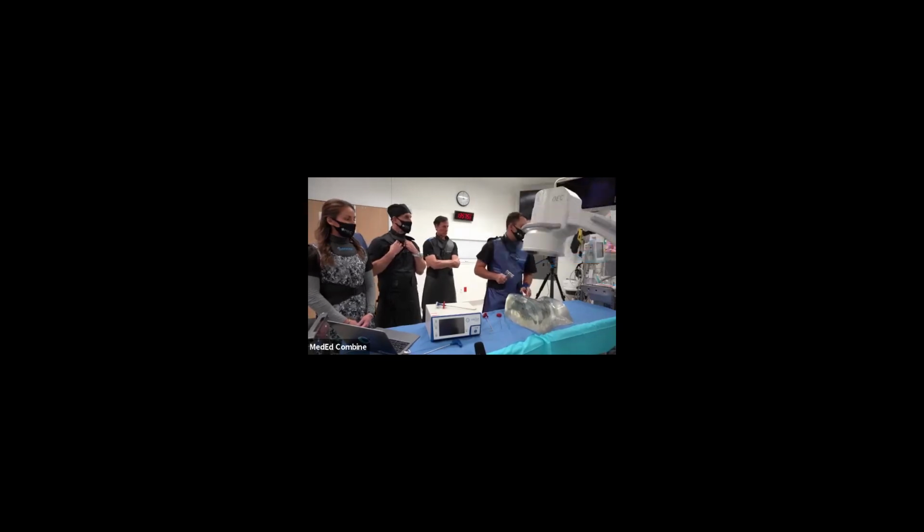We can literally do 10 Relievant cases here if we want to, no problem. So I'm going to tap through. Nice and hard. We're going to have to hit this. So we're working our way through the pedicle. I'm a little high. So we went a little medial through it. Let's see where we're at laterally.